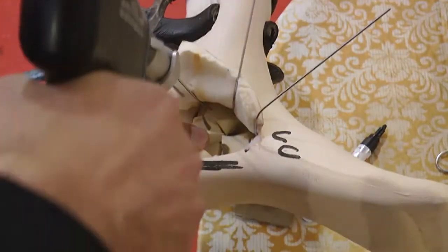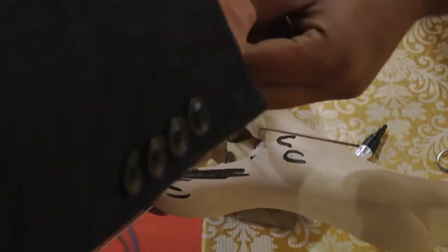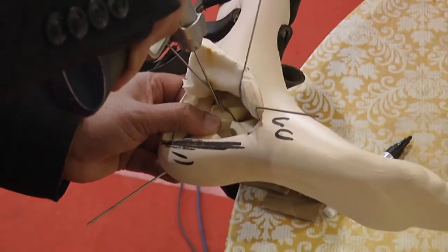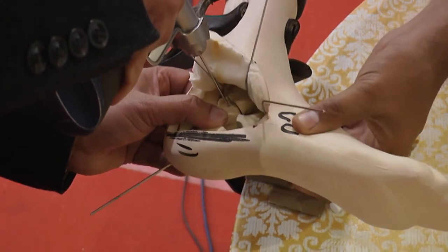So this K wire then starts about 5 millimeter plantar to the articular surface, and the direction is about 10 degrees. So right now I'm absolutely vertical, so I will tilt 10 to 15 degrees towards the heel, my drill goes, and about 10 degrees down, which is the inclination of the sustentaculum.